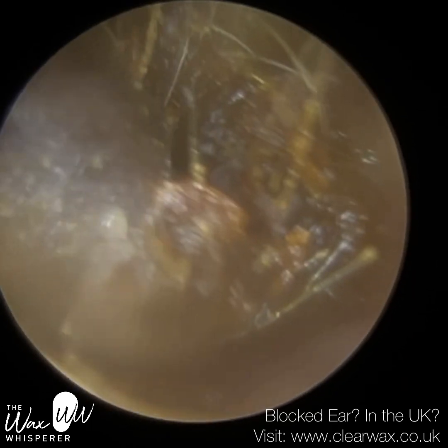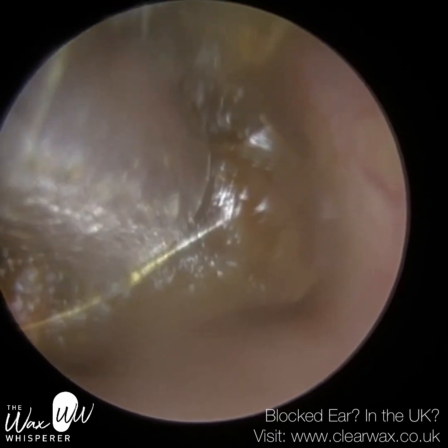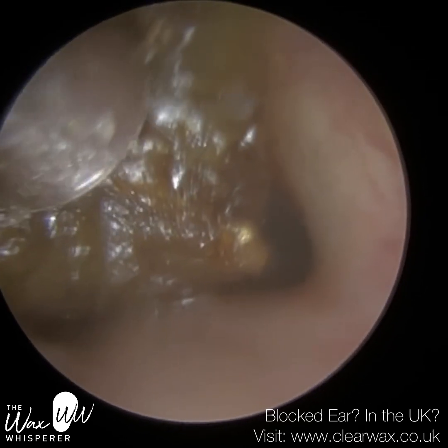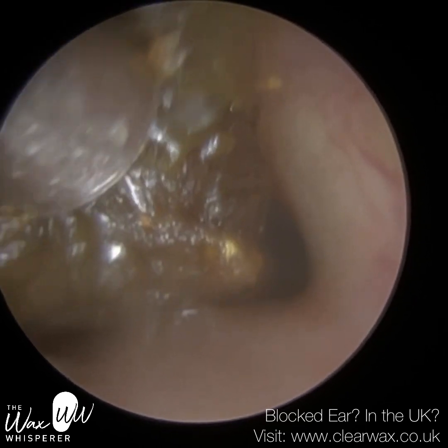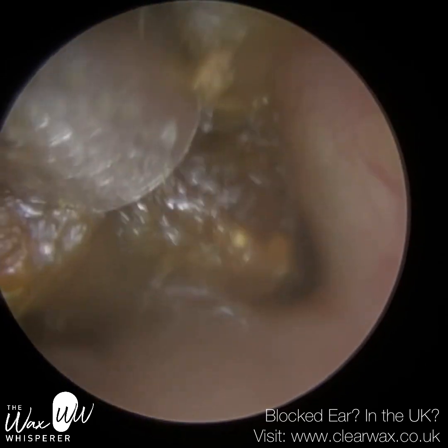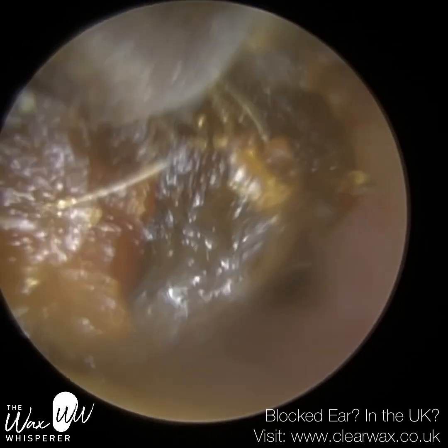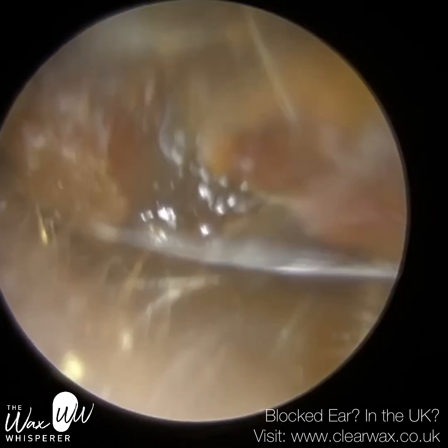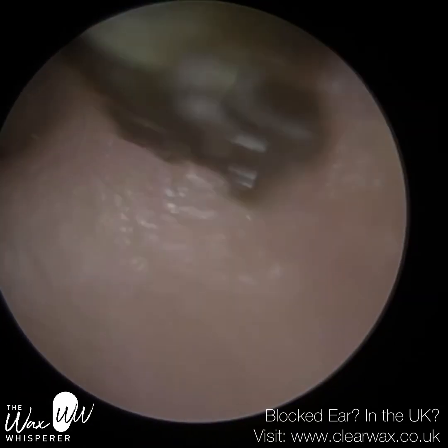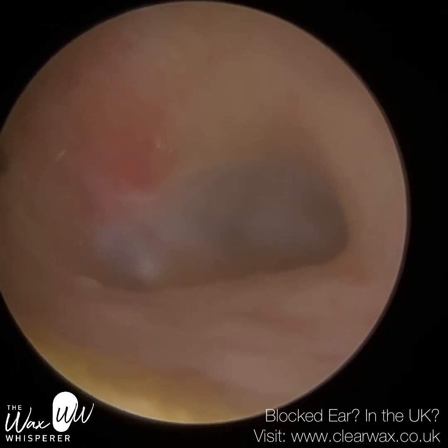So behind this wax plug is directly where the eardrum is. Previously, the endoscope was angled to the right hand side, so the back part of the ear canal. Similarly to their right ear, lifting this plug up, you may already see this patient's ear canal has got a very sharp V bend at the base of the ear canal, so that they've got a deep valley. And then to the left-hand side, the ear canal is almost like a step. The ear canal goes up, then it plateaus, and then it goes back up again. So a slight abnormality there. And again, that potentially can be a cause as to why this patient's suffering from a wax buildup. The wax plug's getting trapped due to the anatomy of the ear.